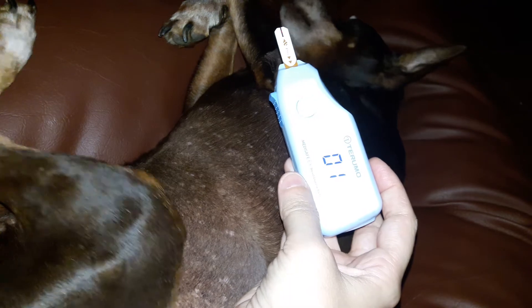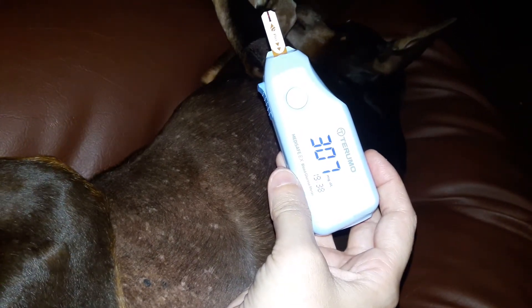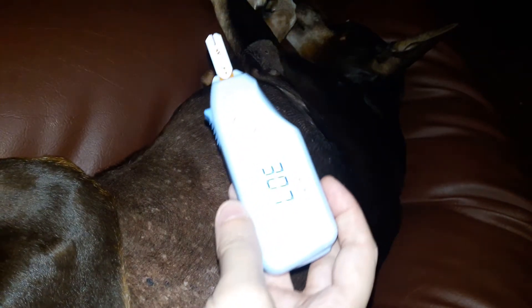It's showing he's at 307, which is just a bit high right now, but that's how you do the testing. He's unaffected — he's still sleeping. I'm just going to put a little bit of antiseptic on that puncture and he's perfectly happy.